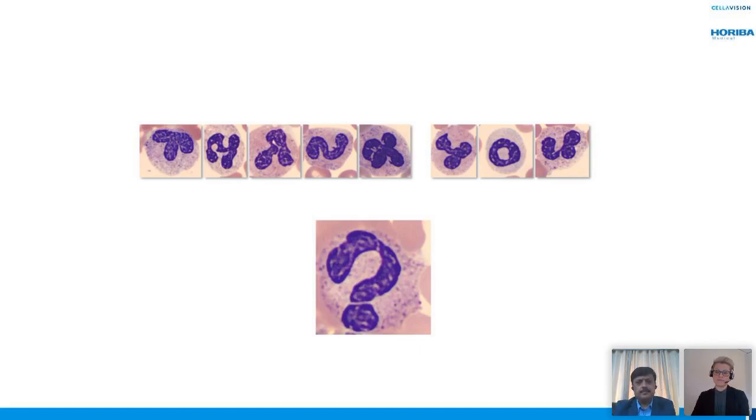Another question is from Mr. Jitendra. Does the small DC-1 require special slides, or can we do it on ordinary ones? No, it doesn't require special slides. We have the same principle for all our systems, and a wedge smear can be run on that as well. So it's not more difficult to run it on the DC-1 than on the other systems in terms of smears.